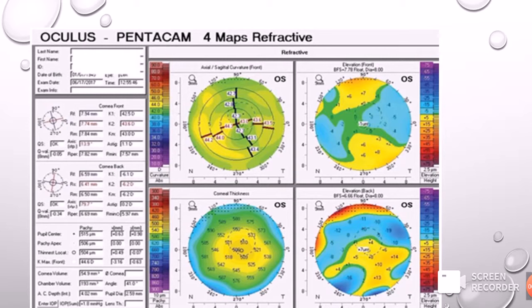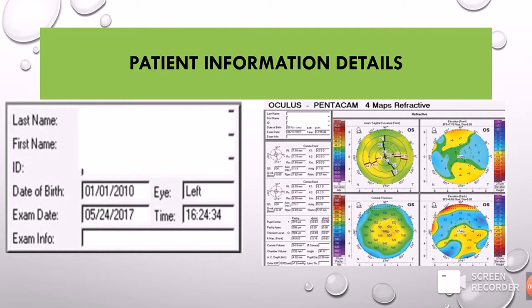This is the typical Pentacam printout of the corneal tomography, in which we can see certain columns and four maps which are presented in a typical Pentacam printout. In part 2 of corneal topography and tomography, I explained about these maps and their basics in detail. I would advise all viewers to visit that video first before entering into part 3. So let us start one by one and see what these printouts consist of.